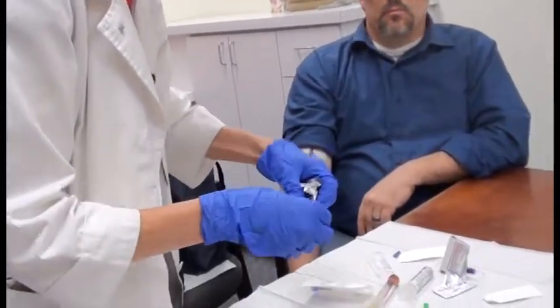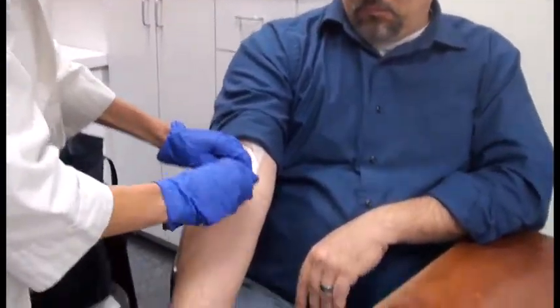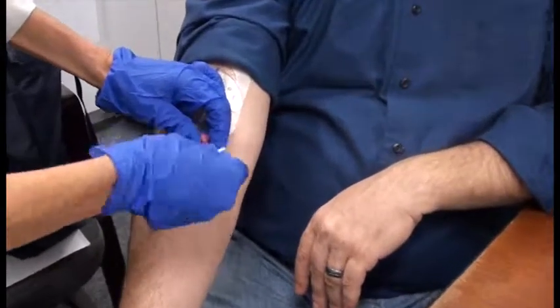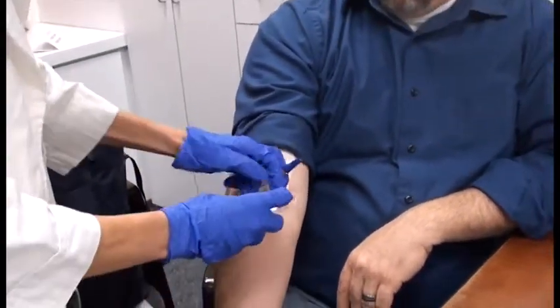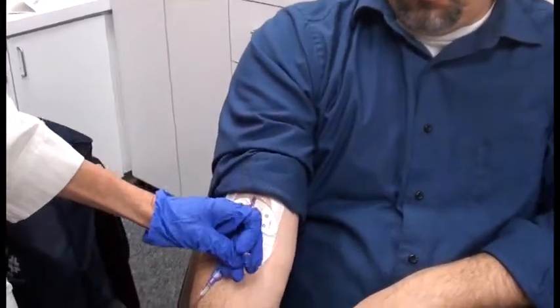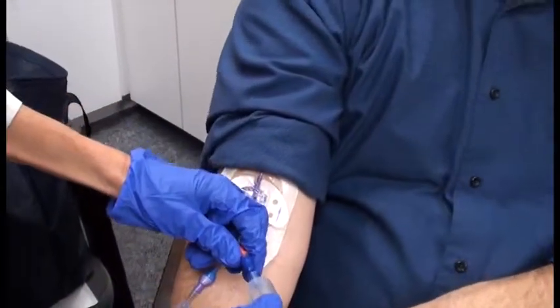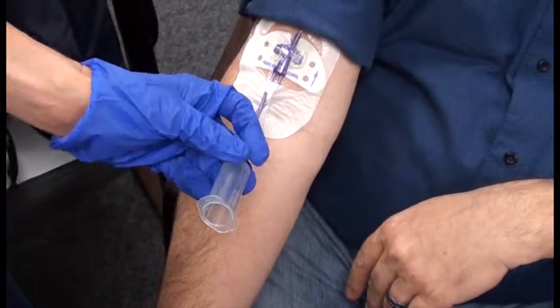So you collect the sample the same way you did before. Clean the cap for the designated period of time. You do the same cleaning technique here and let it dry. And then once it's dry, you simply attach this end to the end of the cap, and you are now free to draw your labs.